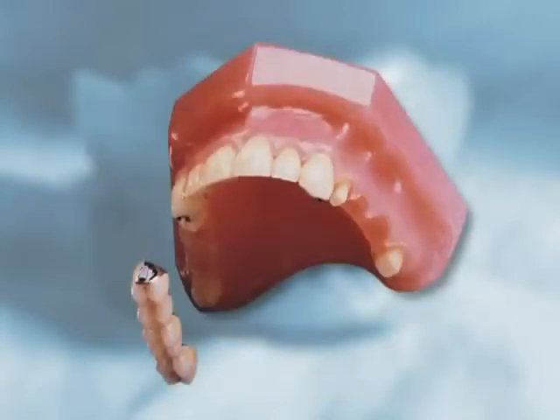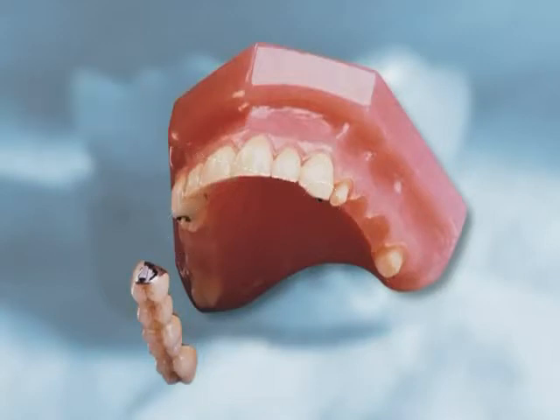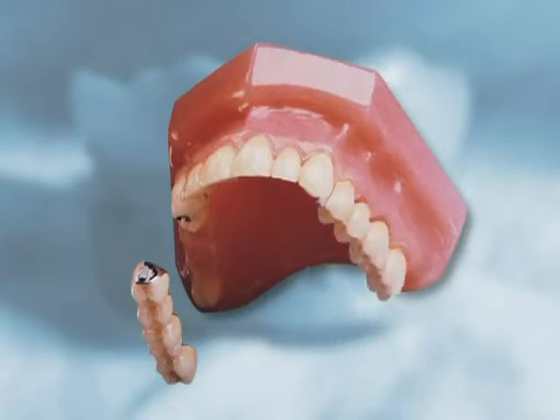A precision attachment involves creating a receptacle within a remaining tooth. The receptacle usually is covered with a crown, and an extending part on the denture fits into the receptacle.